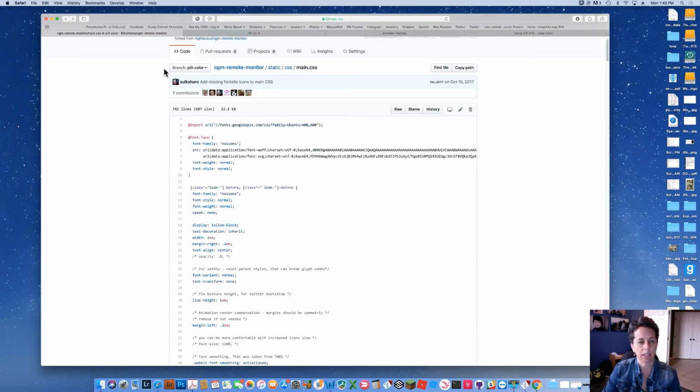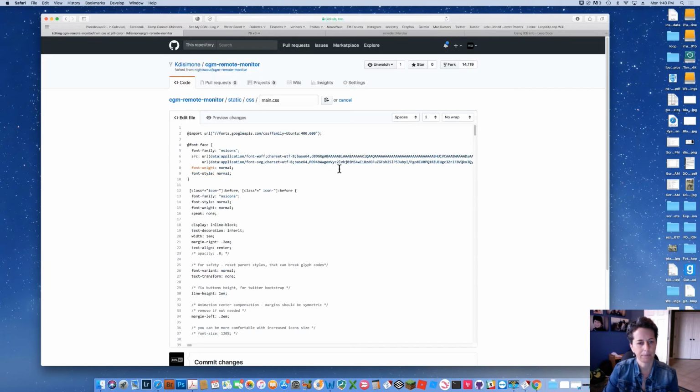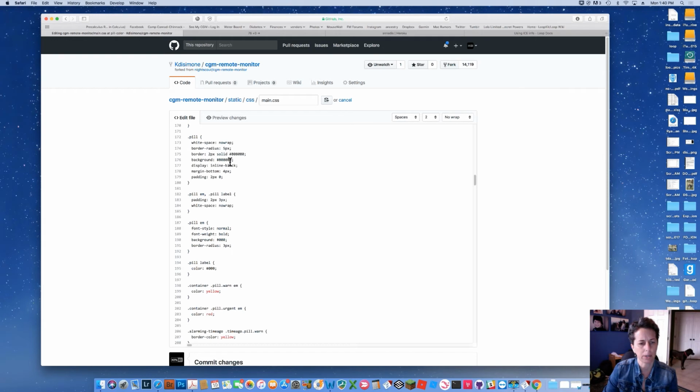I'm going to go back one sec. I think the one thing is I'm making this change on my pill color branch. If I made it on a different branch, I just want to make a note of that, but I specifically am customizing this pill color. So I'm going to do it on my pill color branch. So I'm going to edit this file. And as soon as it gives me the edit, let me refresh, edit, here we go. So I'm going to go down and I think that was probably, here it is. So it's right here in the code and I can find the background color. I'm going to copy and paste what the new color was that I wanted.